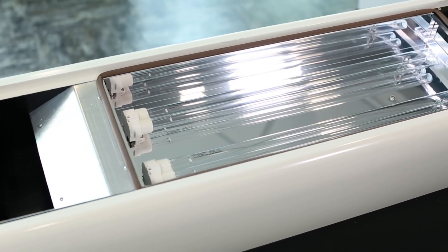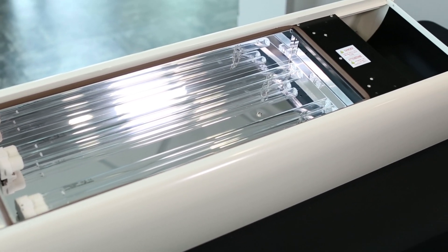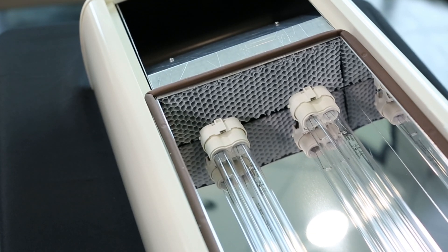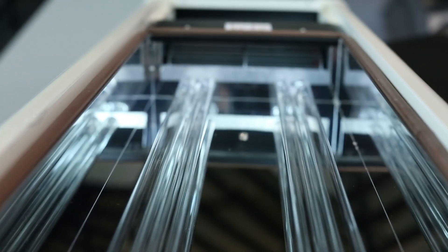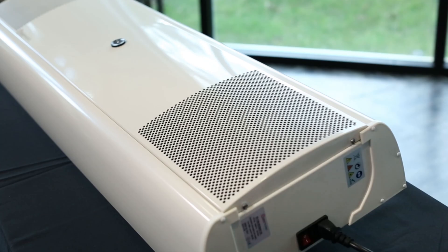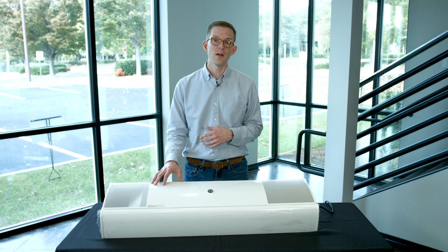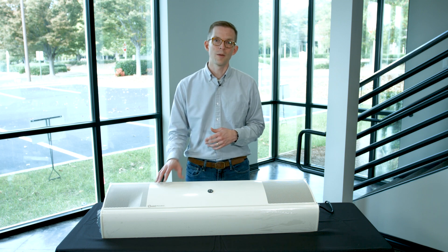The lamps inside this Light Progress unit operate for about 18,000 hours before they need to be replaced. This gives a significant amount of run time or air disinfection time before those light bulbs actually need to be pulled out and replaced with fresh units. So if you're looking for an application to actively disinfect air within a space, this is a great option to consider.